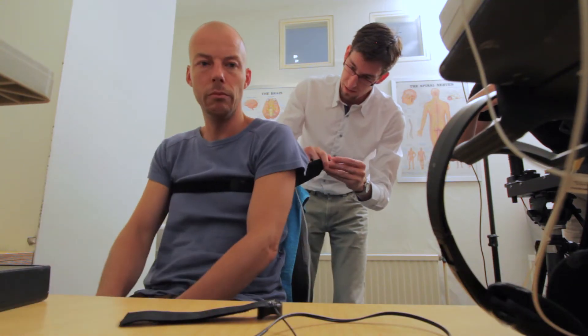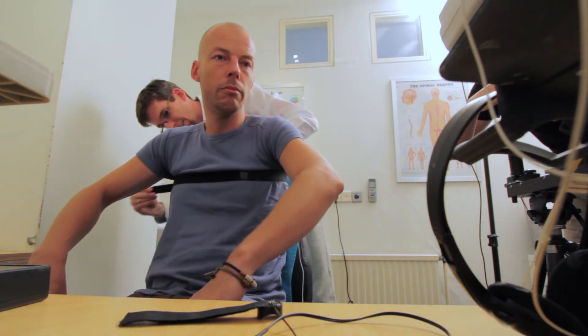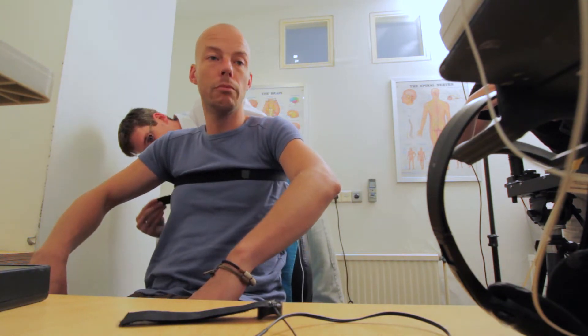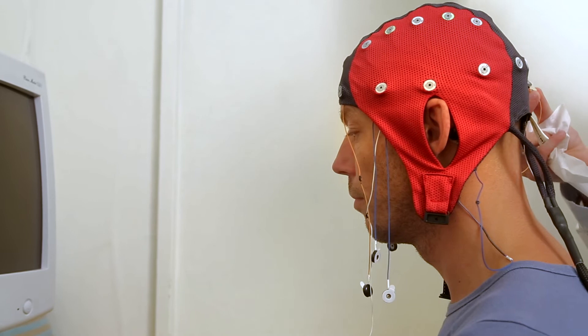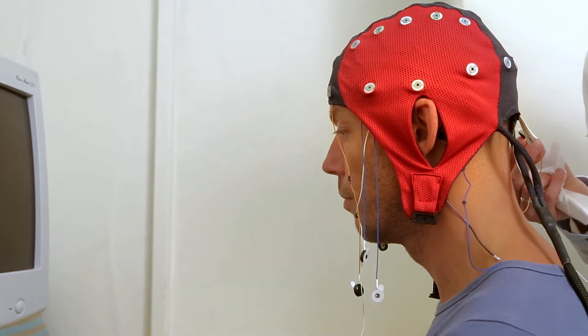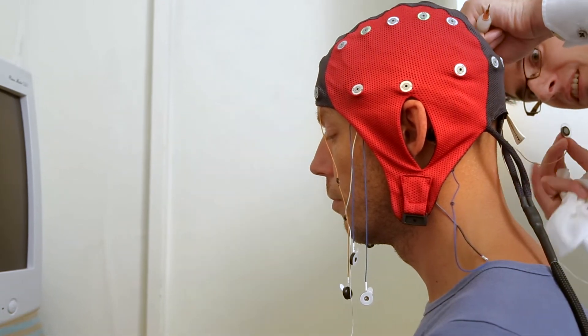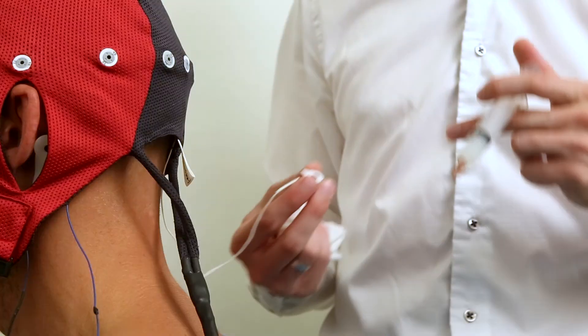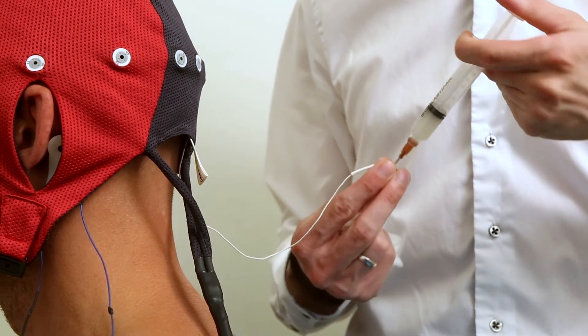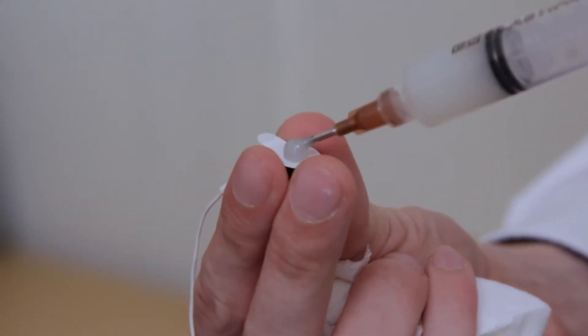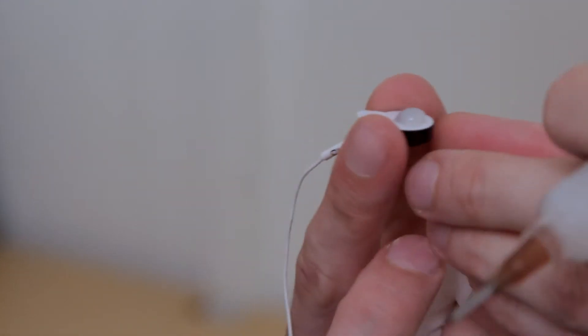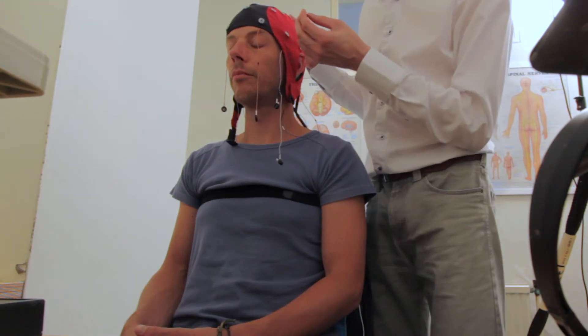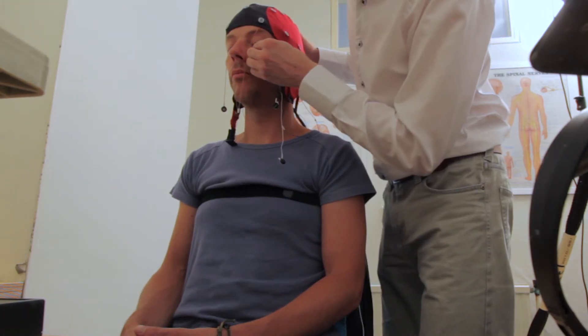After the conversation, the clinician and client proceed to the room where the assessment takes place. The clinician places a specially selected cap on the client's head. This cap contains electrodes that measure the electrical brain activity. The cap also contains a number of electrodes that are attached to several places on the face, such as around the eyes and the jaw.